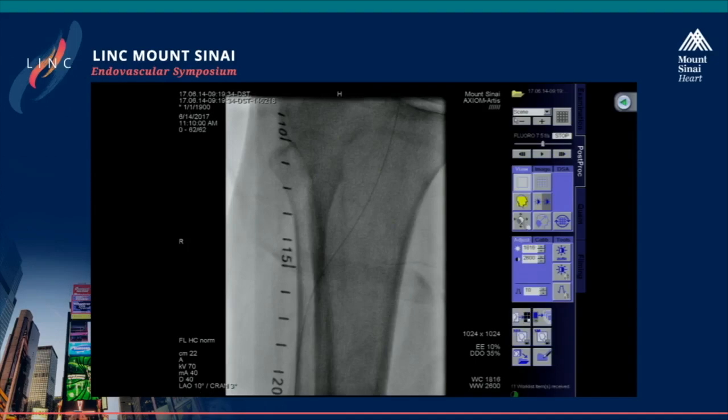But now the question, I guess I'm trying to push and get a consensus from the panel in terms of what would be your treatment. Would you do a DCB? Would you do a Supera? Would you leave it with atherectomy and POBA? Or that's it? I guess those are the choices.